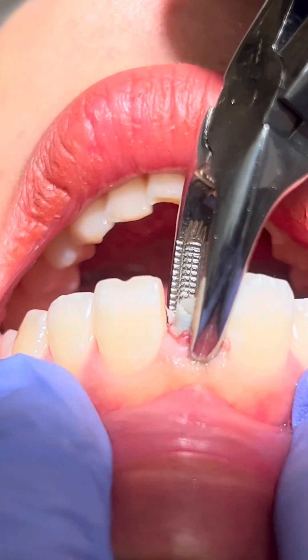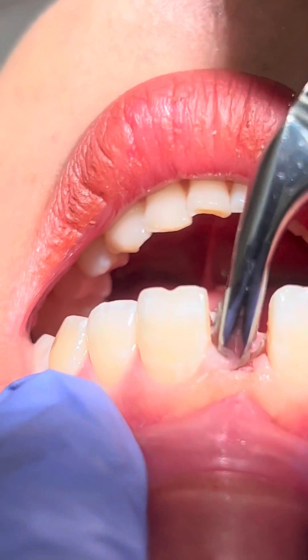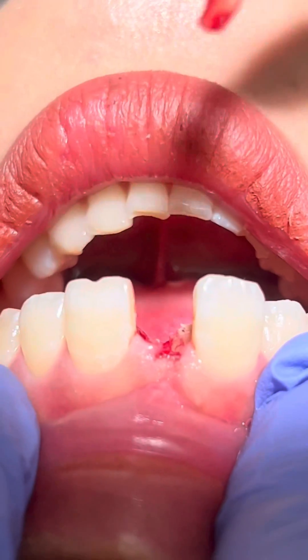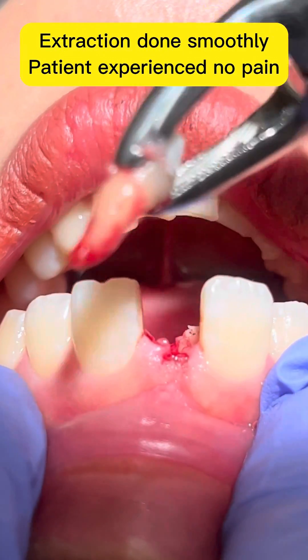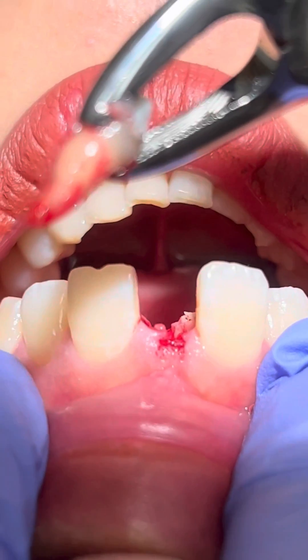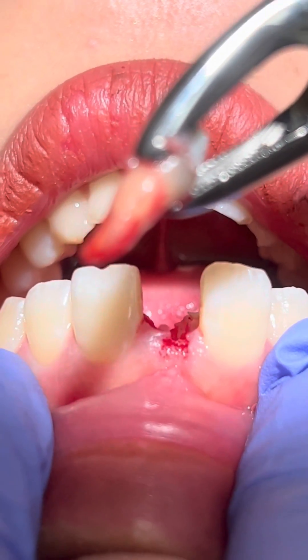Now that the crown is out, we will proceed with the tooth extraction. As it is evident, the tooth came out very easily and the patient did not experience any pain.